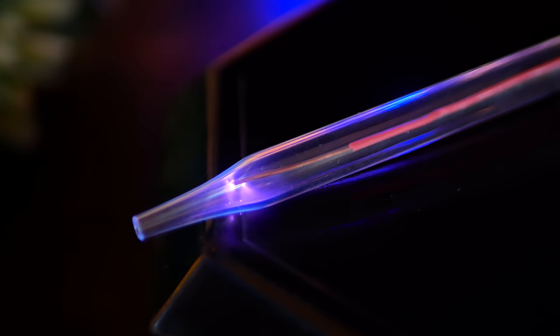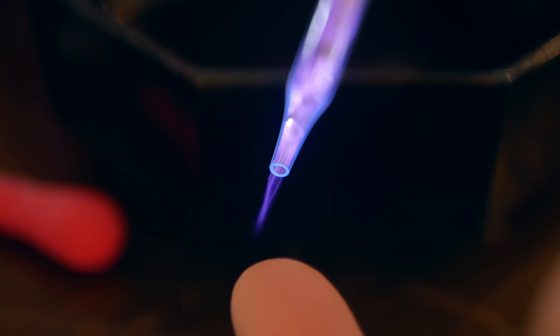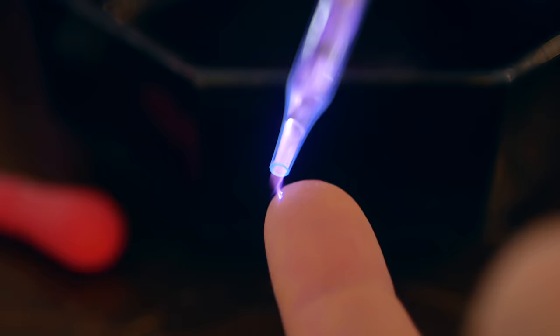You're looking at a functional plasma wand, and it doesn't produce your run-of-the-mill plasma. It produces a very specific type called cold plasma, which, if you're wondering if that's actually cold, it is, but that's not the most remarkable thing about it. Imagine a device that can spot sterilize a wound and speed up healing.